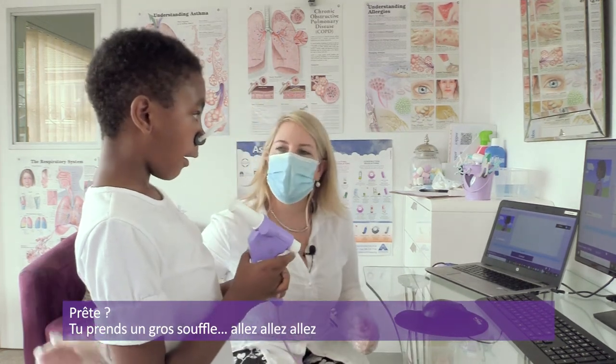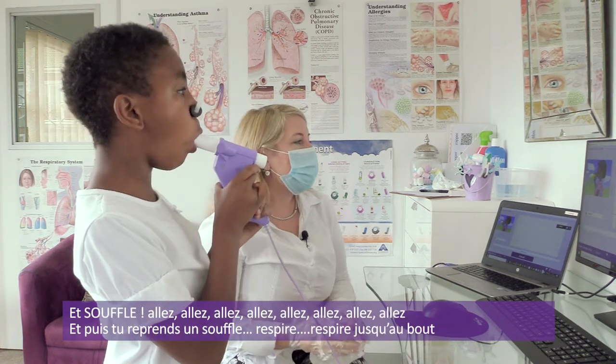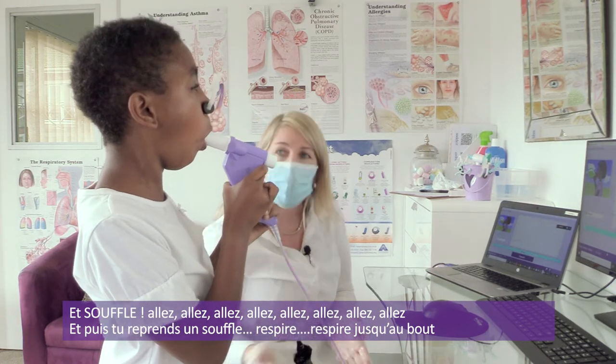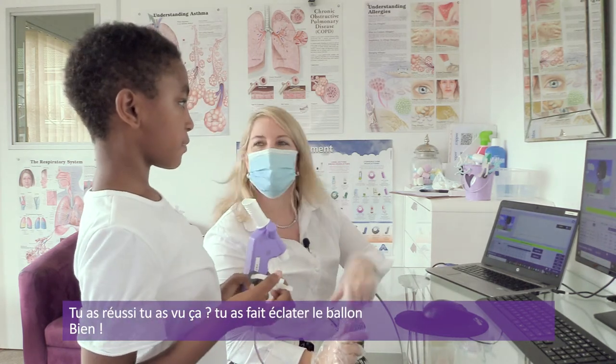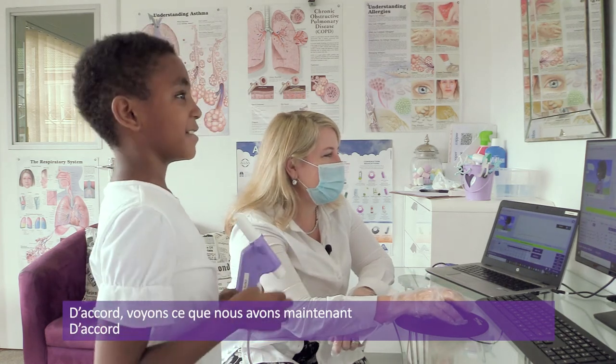Okay, nice deep breath in. All the way as fast as you can. Big, and blow. And breathe in all the way to the top. And rest. Take it out your mouth. Good. Well done. Excellent. You got it. Did you see that? You burst the balloon. Well done. Okay, let's see how that one looks.